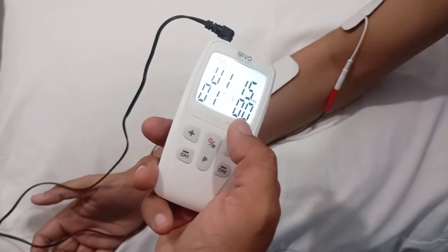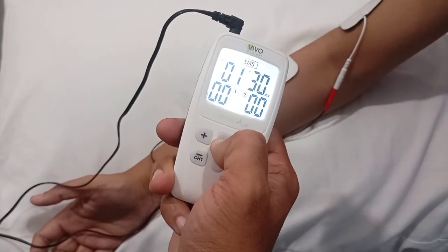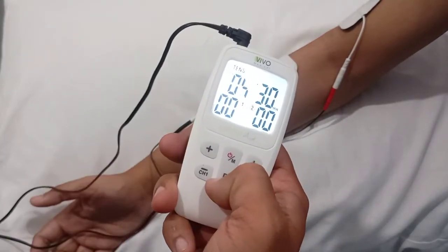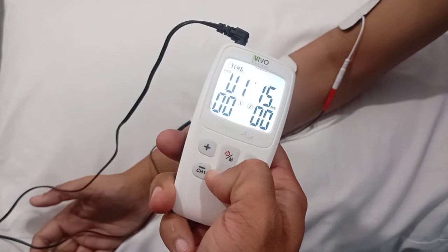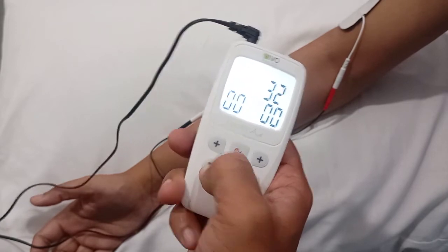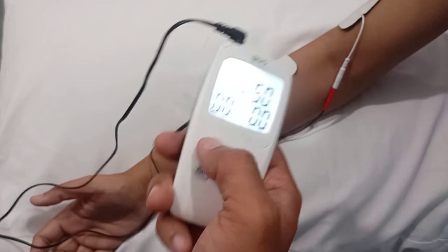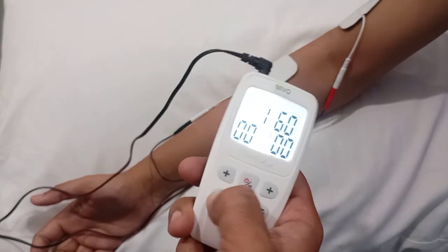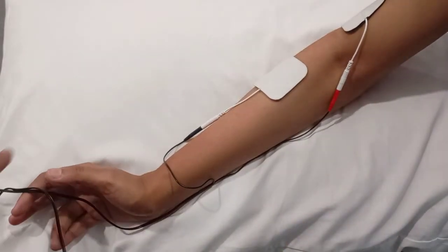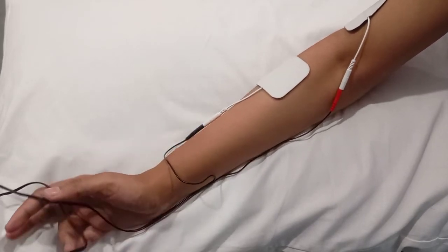Now let's assume the same patient comes with a chronic condition. We turn the unit off, then back on, keep the mode to TENS, and set the program to user defined one. The frequency needs to be less than 50 — let's set it to 25 Hz for day one. Pulse width remains the same. The intensity will be set to maximum, and you may also see some muscle movements. There should be visible contractions in chronic conditions.